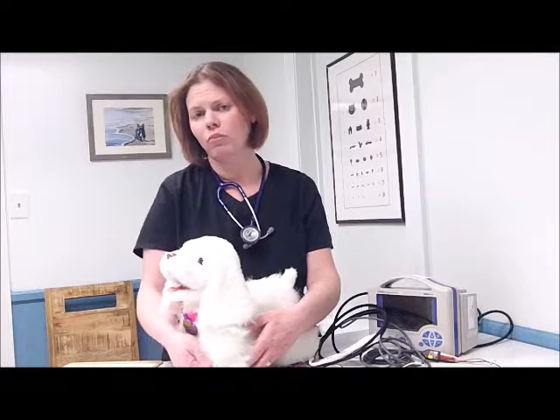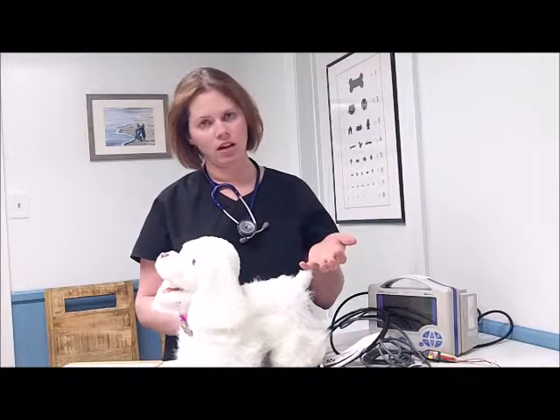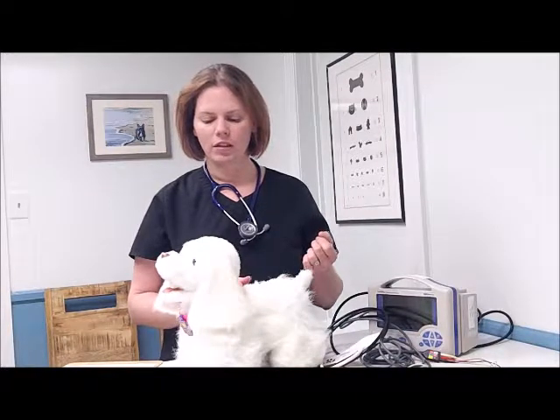Ideally, it's a significant amount of pressure, but they should have basically a deep pain response where you apply that pressure and they're going to pull back. That is really helpful when you're masking down a patient using just, not a chamber induction, but a mask induction, because you're going to miss some of the other parameters that are more visual on the face because the mask is covering them. So that is one parameter.